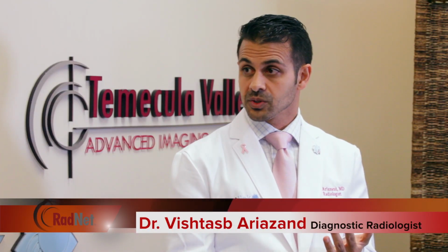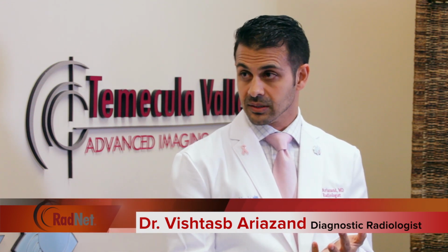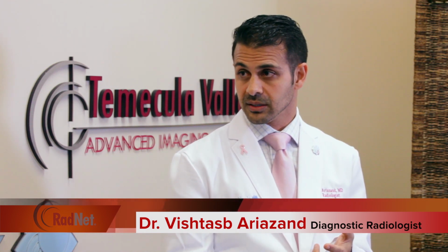Okay, so breast imaging, there's a variety of different ways that we can look at that. Give me an example of some different kinds of imaging. Well, basically, what we do is very methodical. So there's mammograms, which uses x-rays to look at the breast. There's ultrasound, which uses sound waves to look at the breast. And then MRI, which uses radio frequencies to look at the breast. And there's other ways to look at the breast which are not as common, with nuclear medicine and things like that. But primarily, we start off with a breast mammogram as a screening tool.